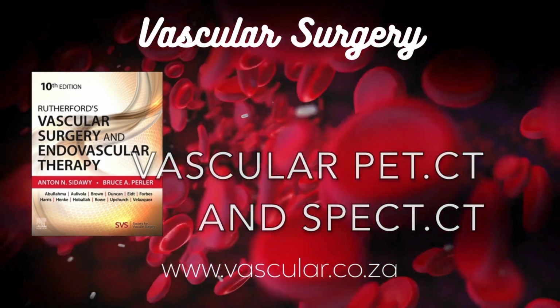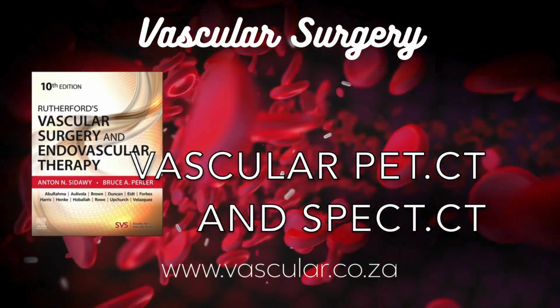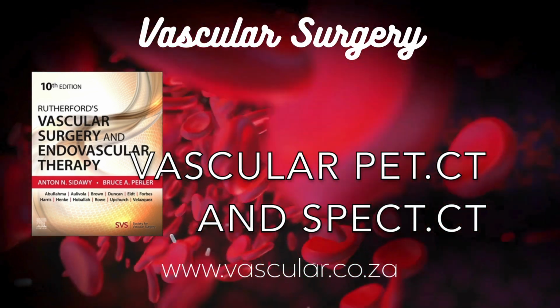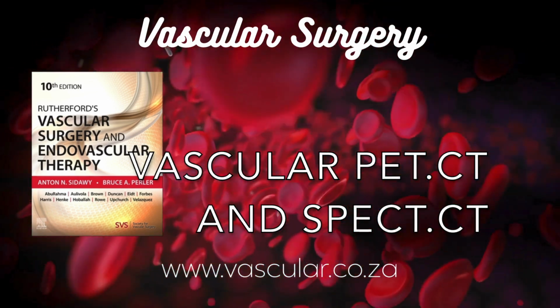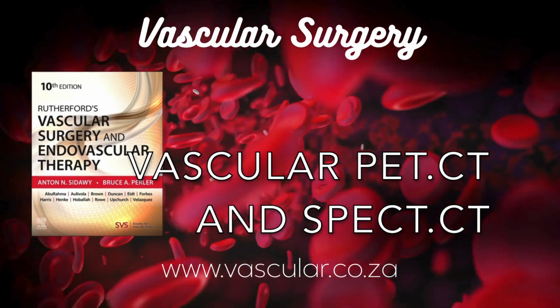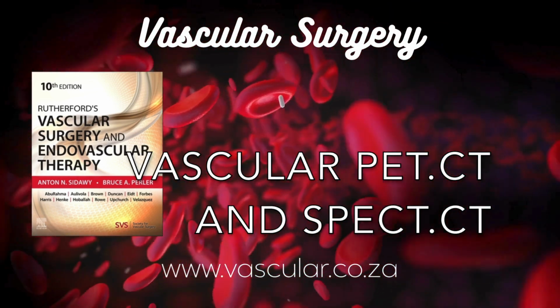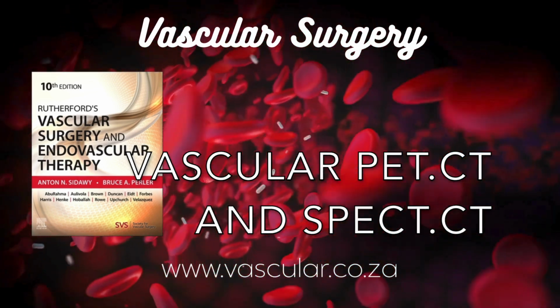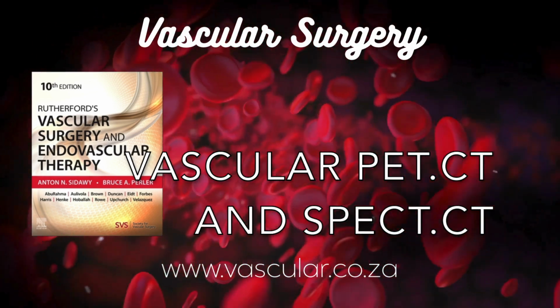It sounds incredibly complex, trying to tag every little step in the process. It really highlights how complex atherosclerosis is. But a key takeaway from the reading, and it's important for you listening to know, is that despite all this research and these different potential tracers, none of them, apart from FDG and perhaps NaF in certain contexts, are really in widespread routine clinical use, specifically for identifying vulnerable plaques, the ones likely to rupture. So still mostly research tools.